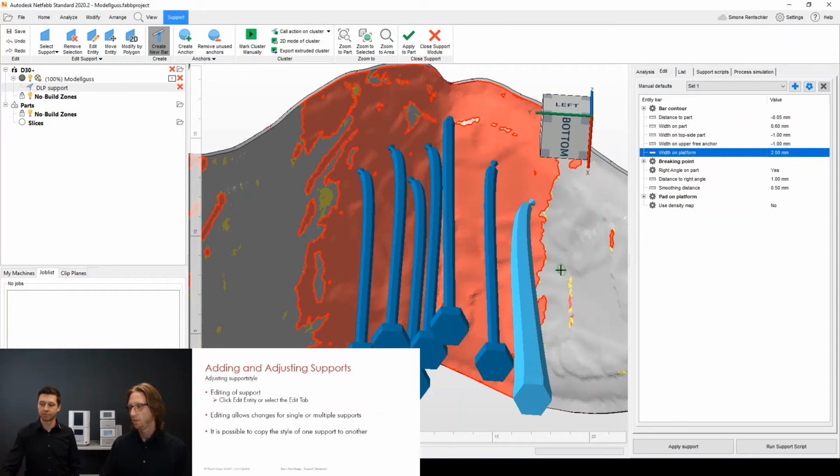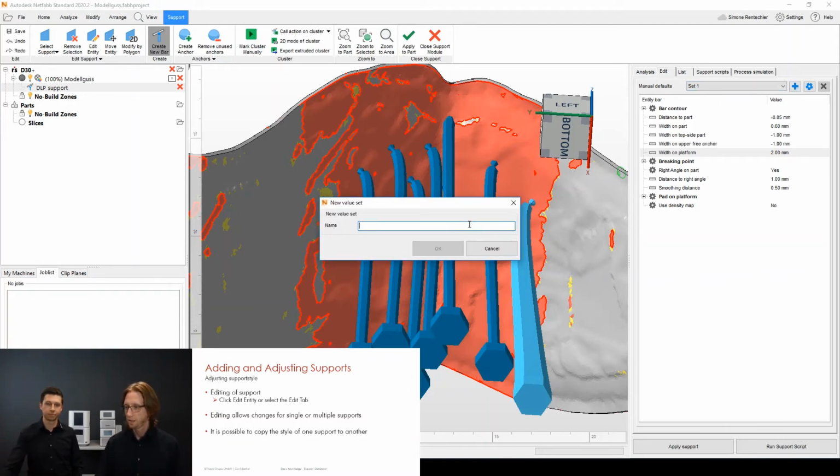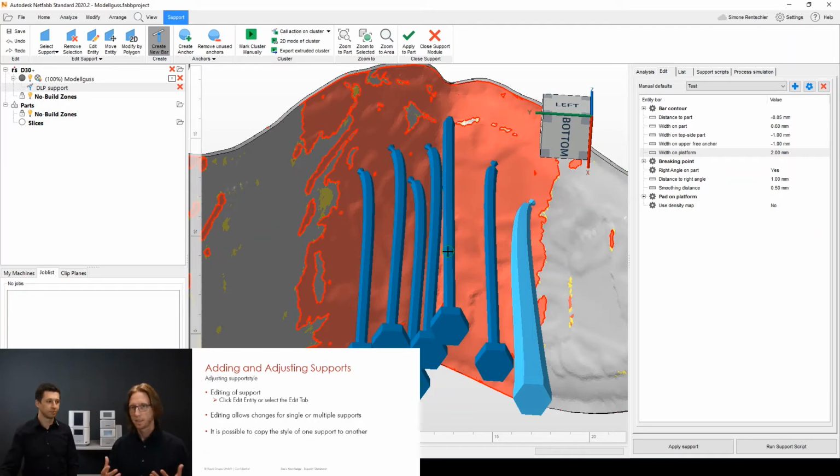And let's say I want to apply the changes from this support to all the others, or the new ones which I want to create. This way you have to actually create a new default setting. So let's see what we got here. We got in the drop-down menu just one setting, set one. This is the default one, which we just used. Let's go to the Add button over there. And again, for the purpose of training, I just call it Test Set. Well, and in this test set, we have to save the changes first before we do anything else.